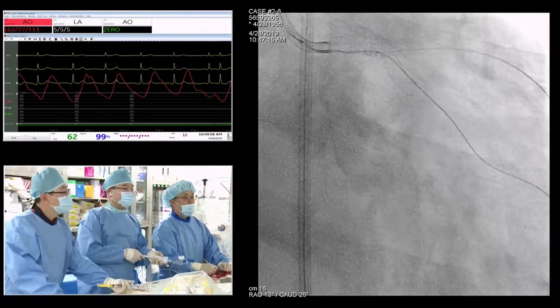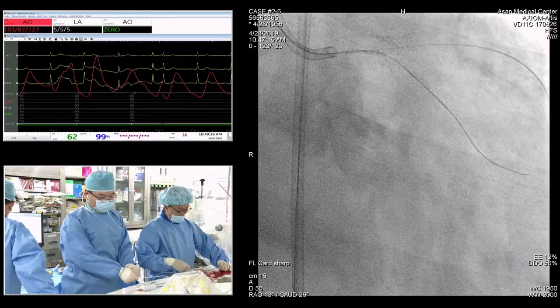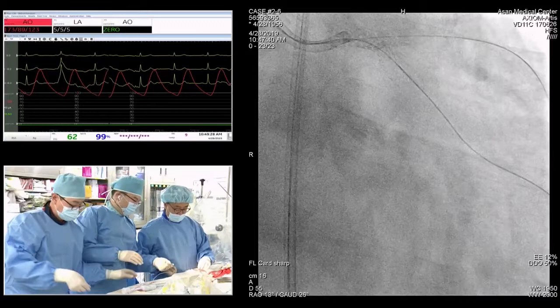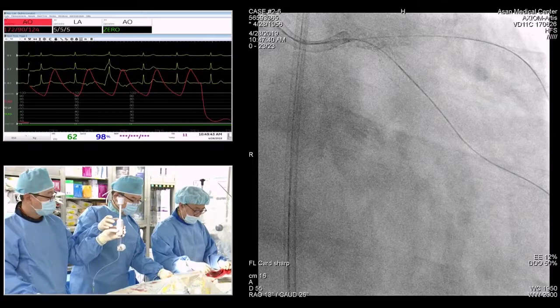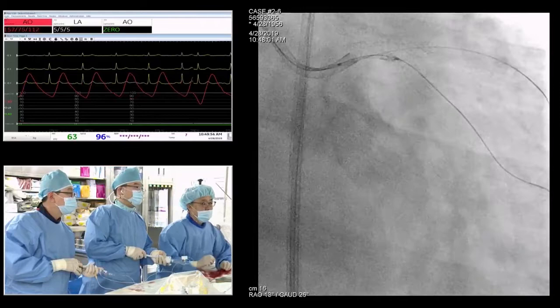Will you do a final POT when you're done with that? This is a 2.5. Sometimes at that portion the wires seem to overwrap, and at times we require pulling back the main branch wire and then recrossing. Okay, this is 2.5. What size of the balloon?